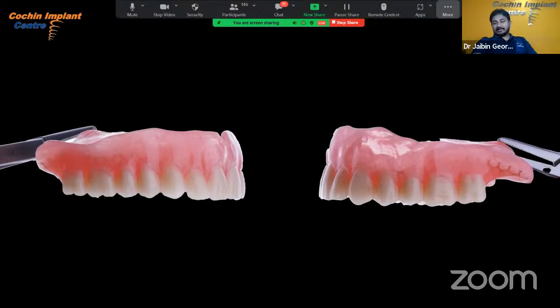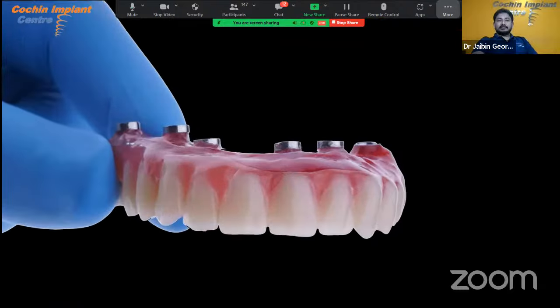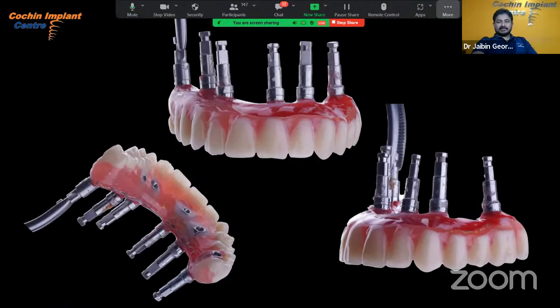This is how we make a conversion process. The denture was made before the surgery, and we attach the multi-unit abutments, and we use titanium cylinders, and we did the pickup. So you can see the denture with the female part of the multi-unit abutment. And we can give a screw-retained prosthesis on the same day of the surgery, immediately after surgery.